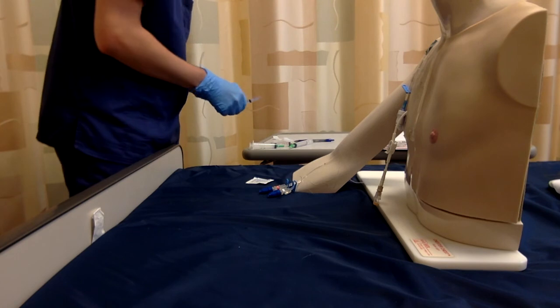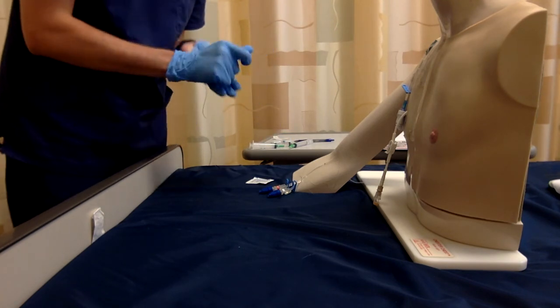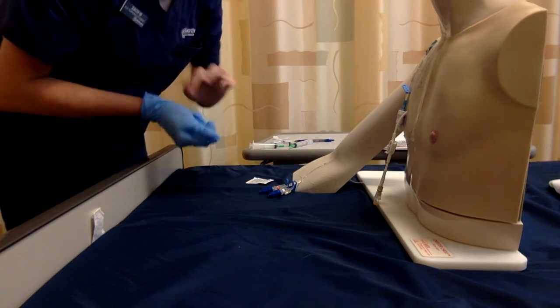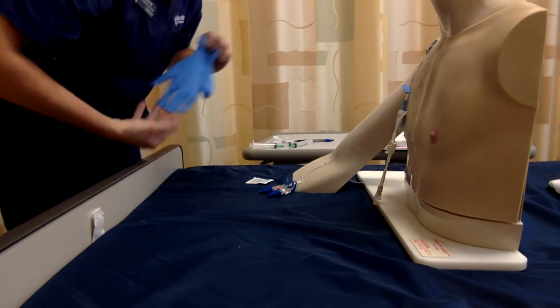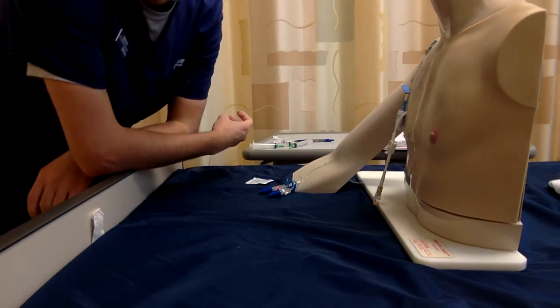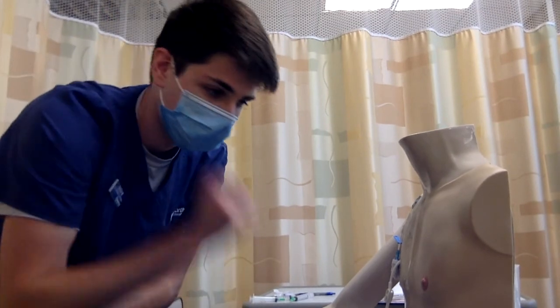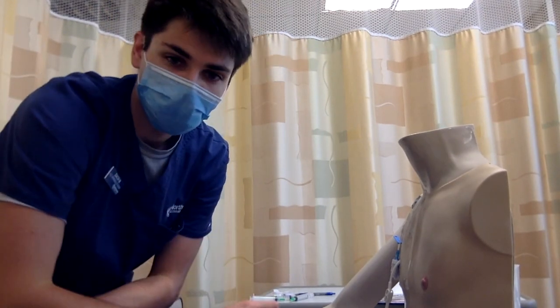giving the medication. Some lifespan considerations could be that with different age groups, you may have to push the medication slower. Obviously, with the PICC line, we're going to want to be looking for any signs of infection, as well as skin integrity, making sure that's okay. And yeah, fun stuff.